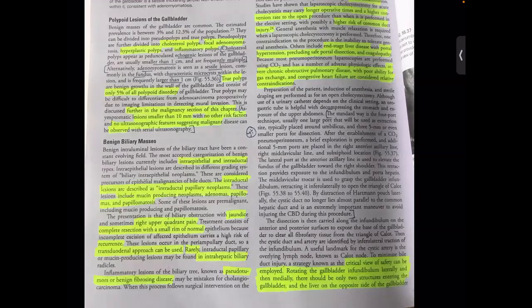So next, the midclavicular port. The midclavicular port is used to grasp the gallbladder infundibulum and retract it infralaterally. This action of retracting the infundibulum infralaterally will open up Calot's triangle. By distraction of Hartmann's pouch, that is by pulling the infundibulum infralaterally, the cystic duct is no longer parallel to the common hepatic duct. So the cystic duct will come perpendicular, and it will be separated from the common hepatic duct. This maneuver will avoid injury. So this is a very important retraction.